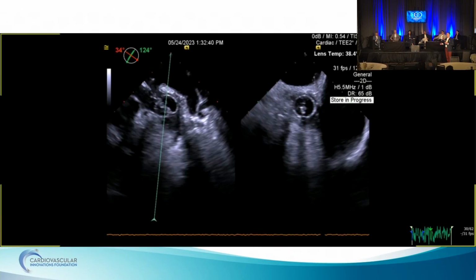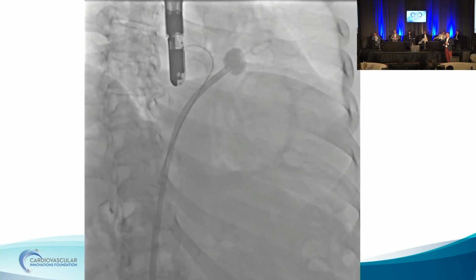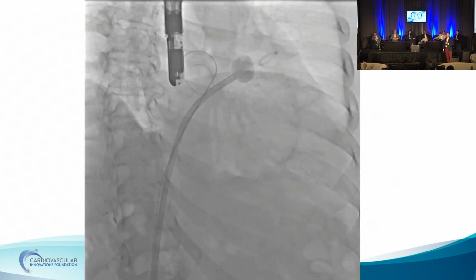We then inflated the balloon further so that now we're actually occluding the ostium of the appendage. And we set up this contraption. So what we did was we wanted to be able to aspirate from the SafeCross sidearm, but small volume, so we also provided some saline through this pigtail catheter to basically create a lavage. And we used the pigtail catheter tip to helicopter around and also mechanically help stir up some of the clot to loosen it and make sure that we could aspirate as much thrombus as possible. And we did this for roughly 50 cc's of solution with our lavage.